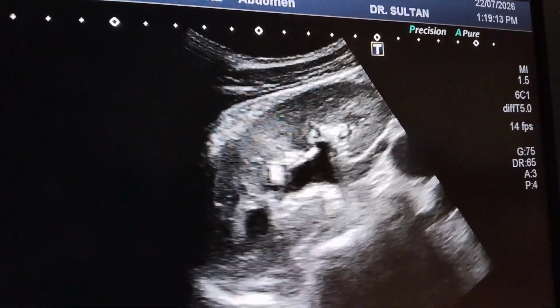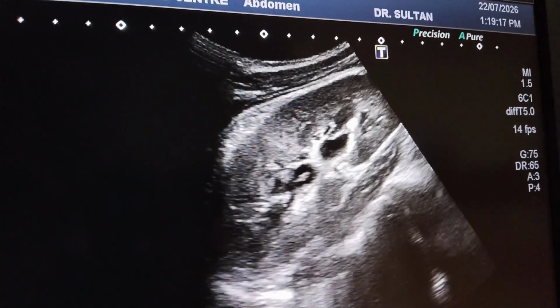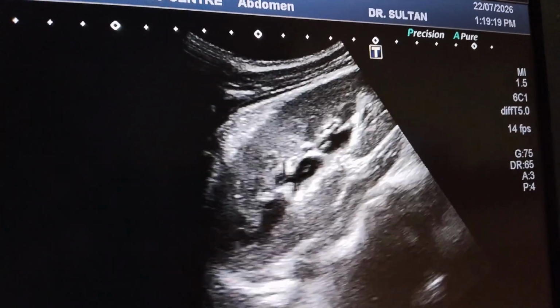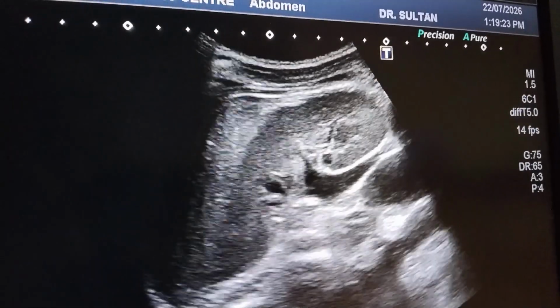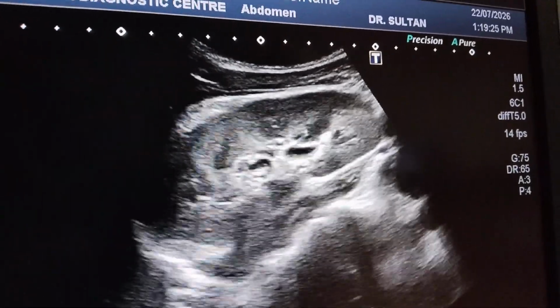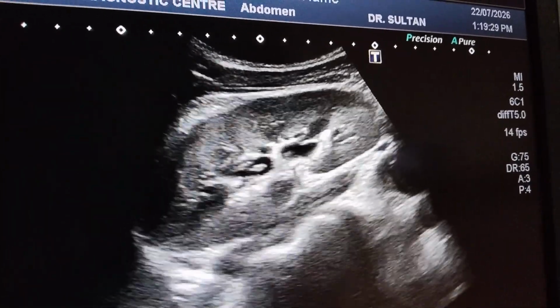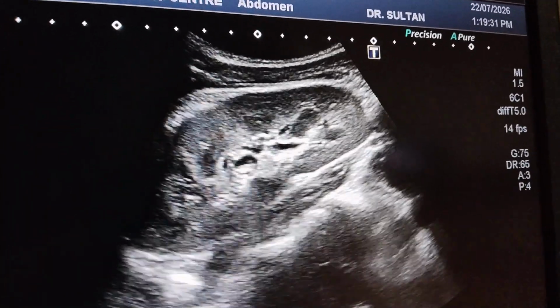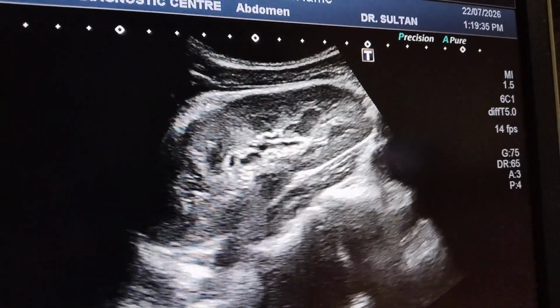So what we have learned is that when we see an echogenic focus, it should be discrete and it should be examined in different planes, longitudinal, transverse, angling the probe, tilting the probe, and then we see that the echogenic focus is fixed and has the same orientation.